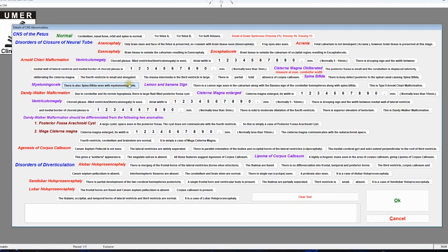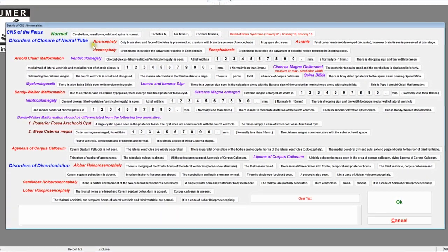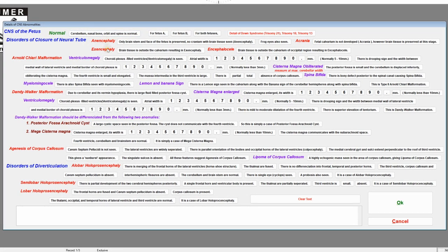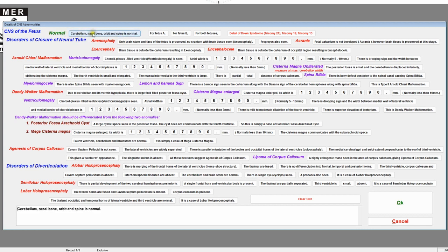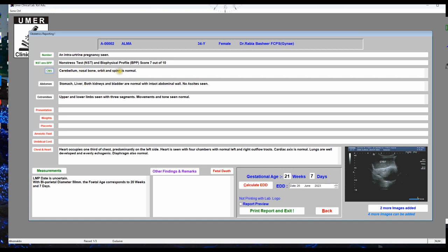Click CNS. Every possible finding is listed here — for example, normal, anencephaly, exencephaly, cerebellum, nasal bone, orbit, and spine. Just click the options you want and they will be written automatically. If you're not comfortable with the auto-written text, you can add or edit it in the text box, or click 'Clear Text' to start over. Then click OK to update the CNS findings.